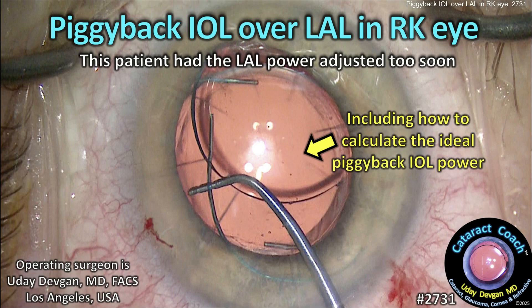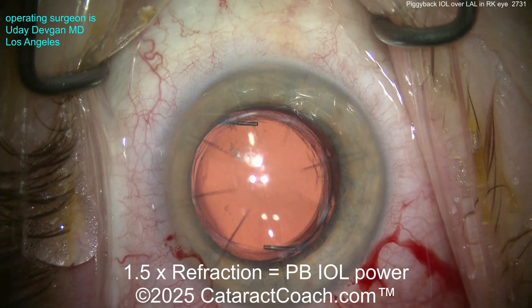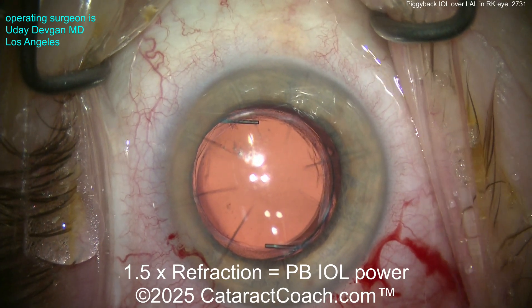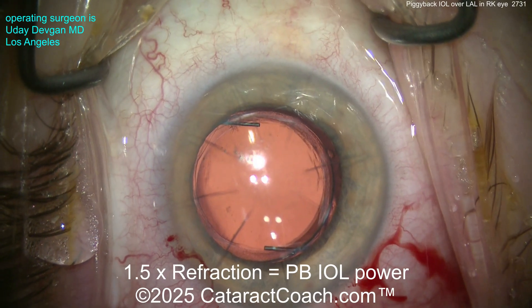cataractcoach.com — piggyback IOL over a light adjustable lens in a radial keratotomy eye. The issue here is the patient had the LAL power adjusted too soon. Here you can see the patient with eight cuts of RK and the LAL light adjustable lens.